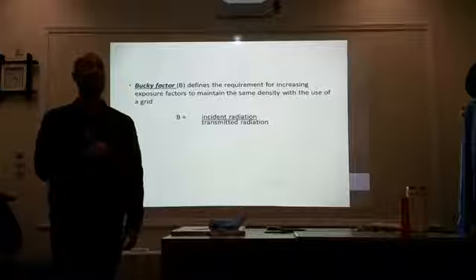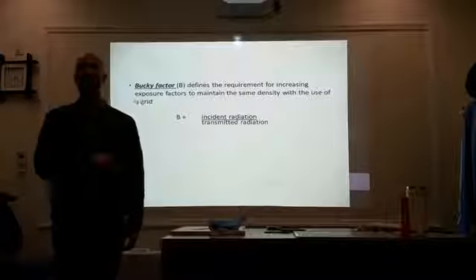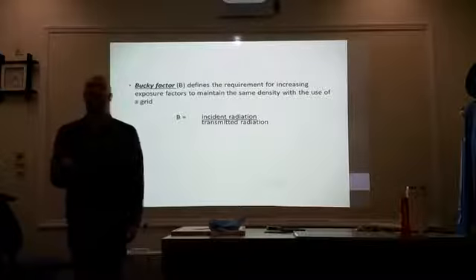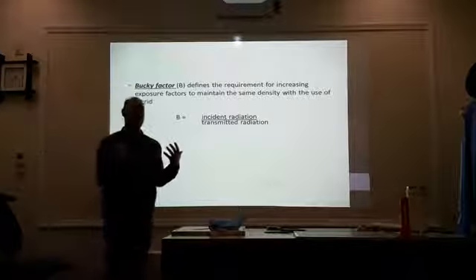Is a higher grid ratio going to have better cleanup than a lower grid ratio? Yes, it's going to absorb more scatter radiation. So because it absorbs more scatter radiation, we've got to compensate for the loss of density here.